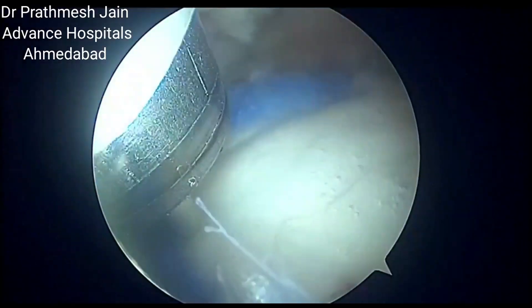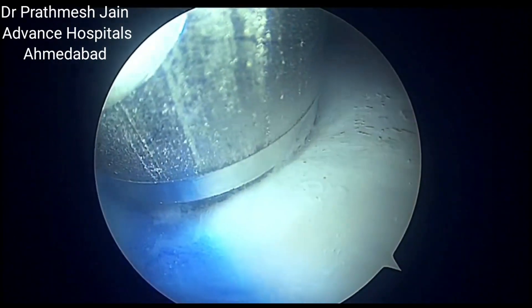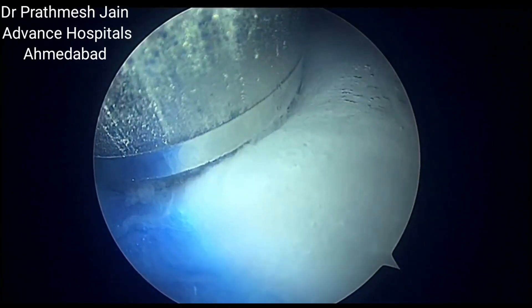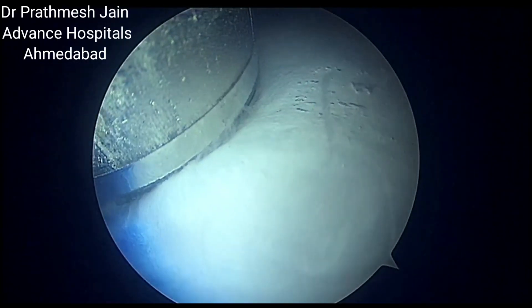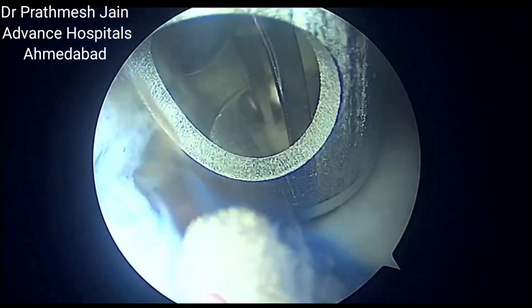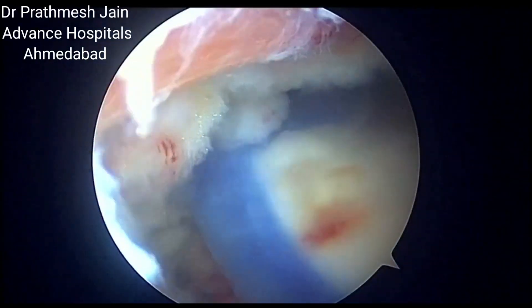There is a small black color trigger which is pulled to place the bone anchor in. The mallet is used to drive it in, and then the bluish device is loaded to push the peak anchors down. Here we can see that the second peak anchor is placed.